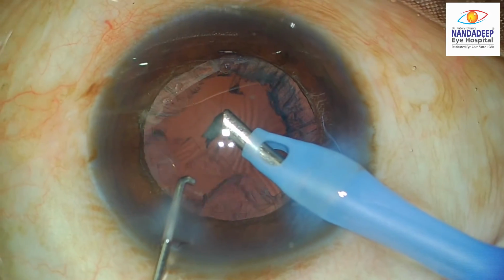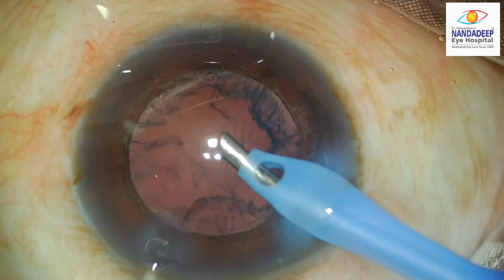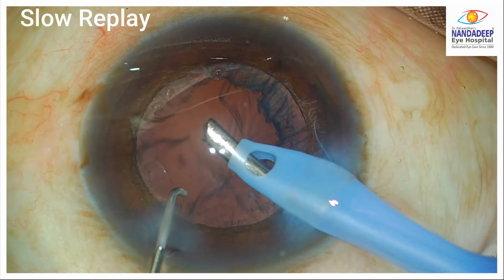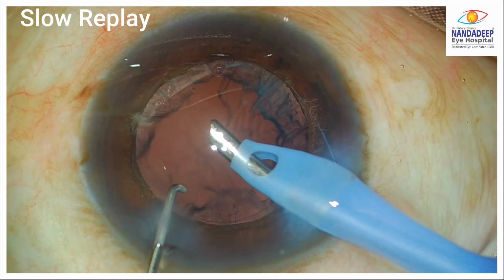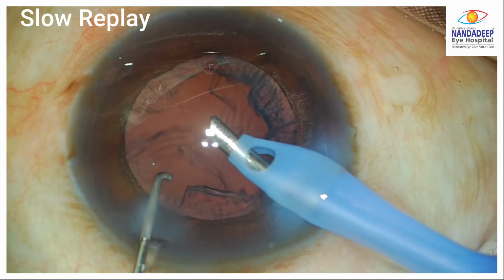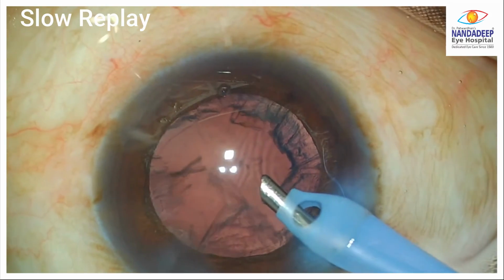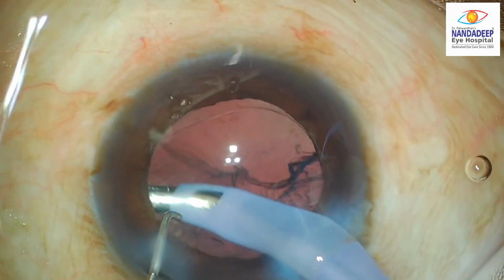So the vacuum was further reduced to provide more safety for the procedure till the last piece. The vacuum was further reduced for the last piece, but despite that, the anterior bulge of the posterior capsule and movement was noted at the time of last piece emulsification. And as you notice, there is no fluctuation of the iris, indicating it was only anterior movement of the posterior capsule.